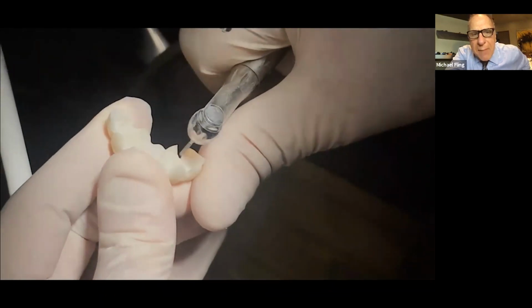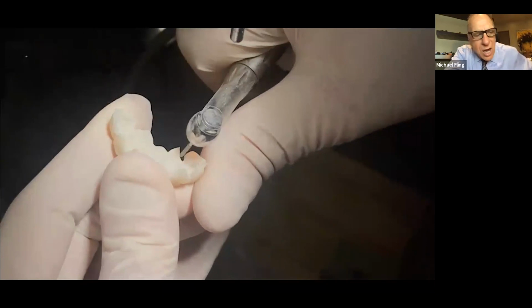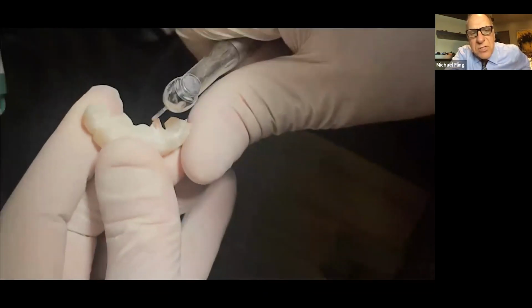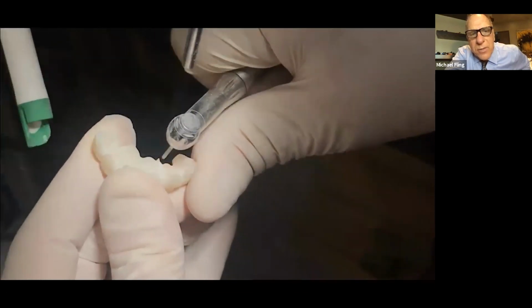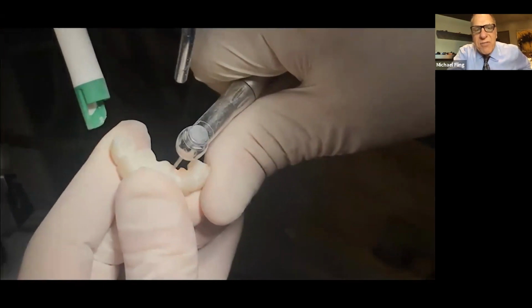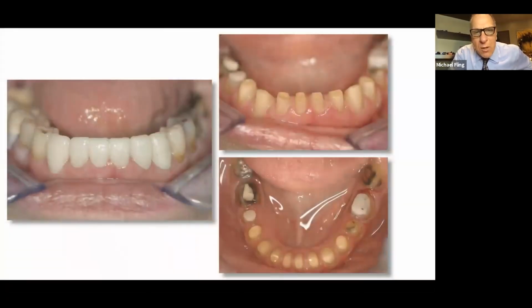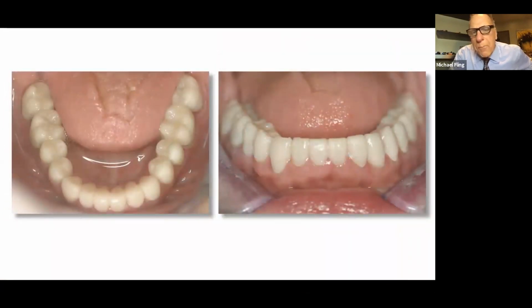While I'm doing the diamond, my assistant has got her high-speed vacuum going, and she's blowing air the entire time so that I can see what's going on. So that's how I get rid of the bulk of the material after I've seated this in the mouth. So I get those trimmed up. The lower posteriors, I already shared with you how I'll make that shell. I'll put bisacryl, more bisacryl inside of it. I can seat it until visually I have it where I want it. I'll clean up those margins.